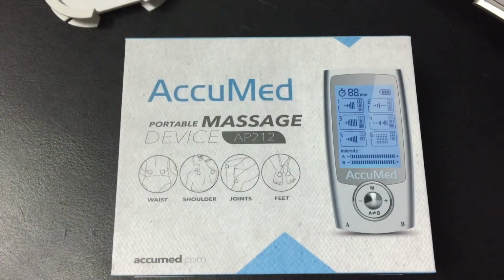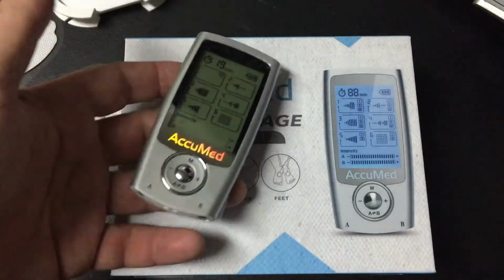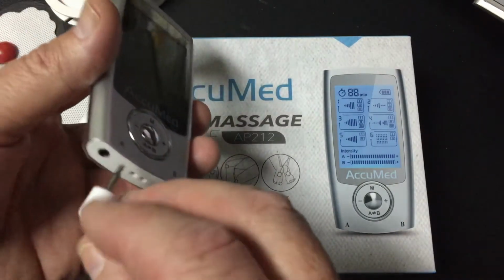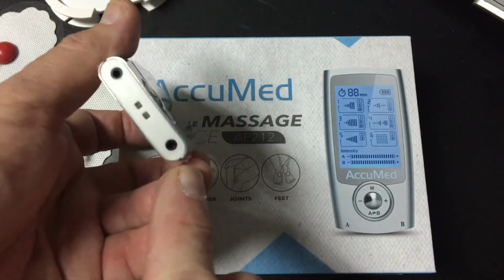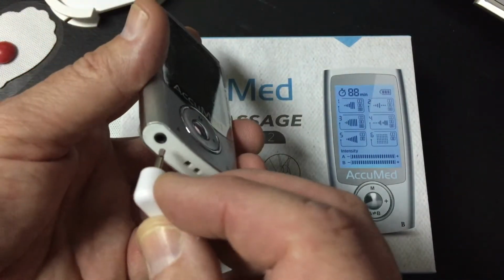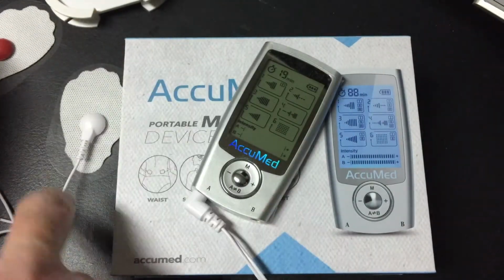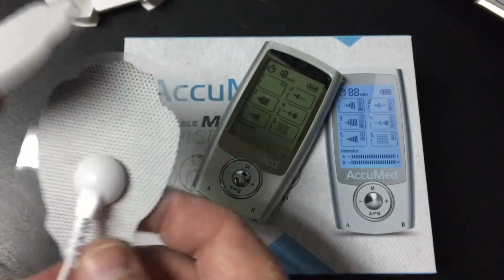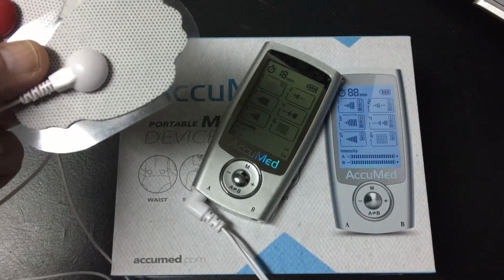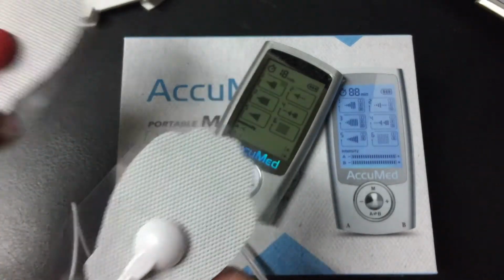Now you can use this as a single channel device or a dual. A lot of times I just use it as a single channel device. Right now we're still on this massage mode. Your channel inputs are on the bottom. You have A and you have B. I'm going to plug into A. Okay, now I'm ready to go. I can attach these in accordance with the diagrams in the user manual. There are also some resources you can look up online for pad placement.